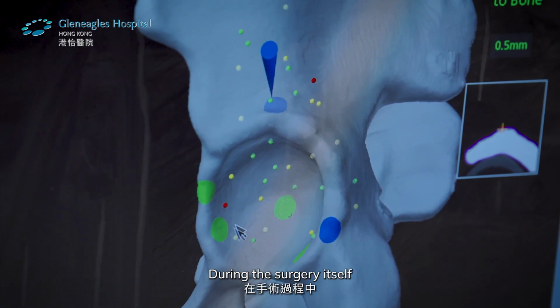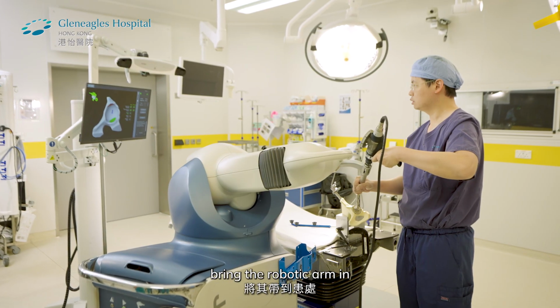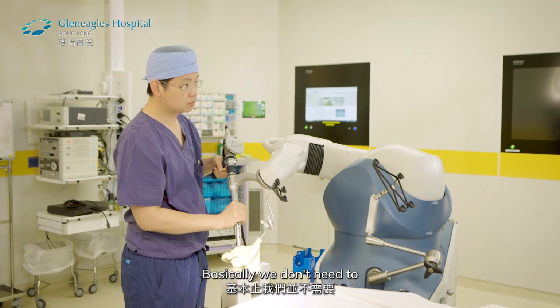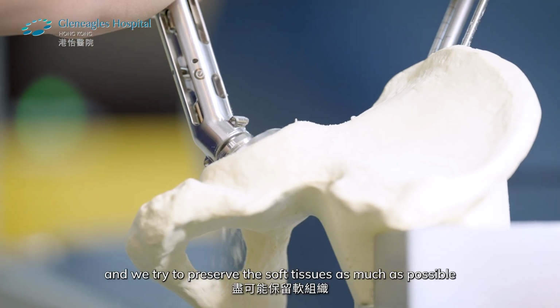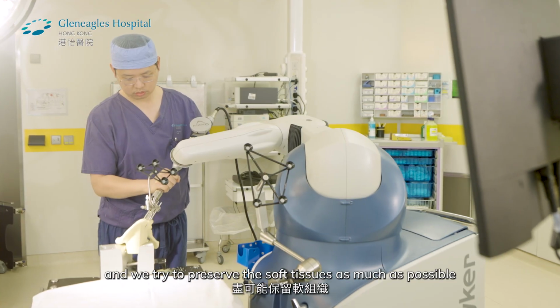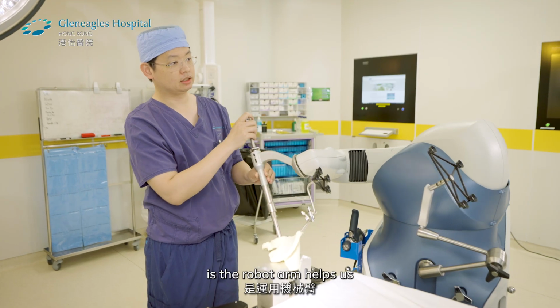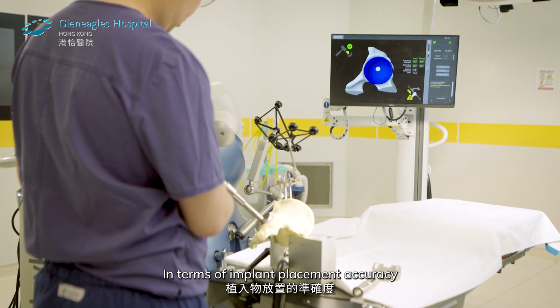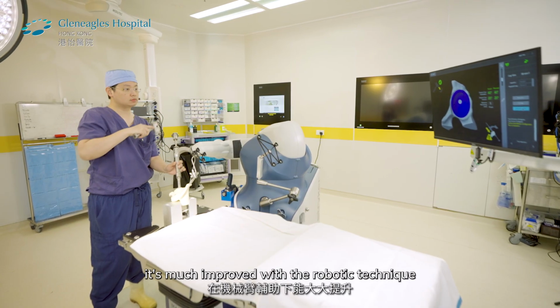During the surgery itself, the surgeon would bring the robotic arm in and help us remove the bone that is diseased. Basically, we don't need to dissect a lot of tissues away, and we try to preserve the soft tissues as much as possible. And then after that, most importantly, the robot arm helps us put the cup into a precise location. In terms of implant placement accuracy, it's much improved with the robotic technique.